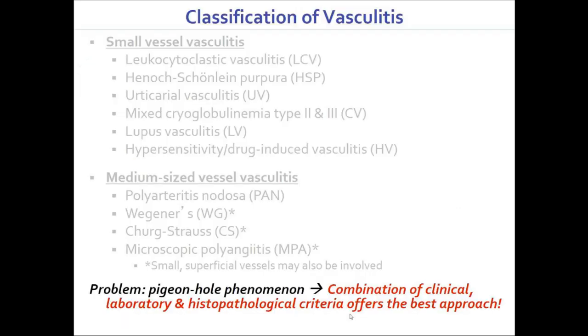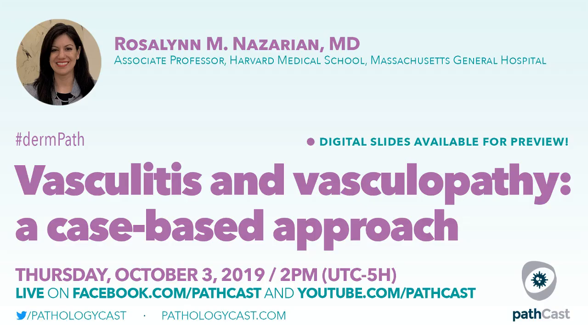So the main problem is truly a pigeonhole phenomenon, and I hope the series of cases that I describe will show you that clinical, laboratory, and histopathological criteria in combination offers the best approach. Let's take a look at the first scan slide.